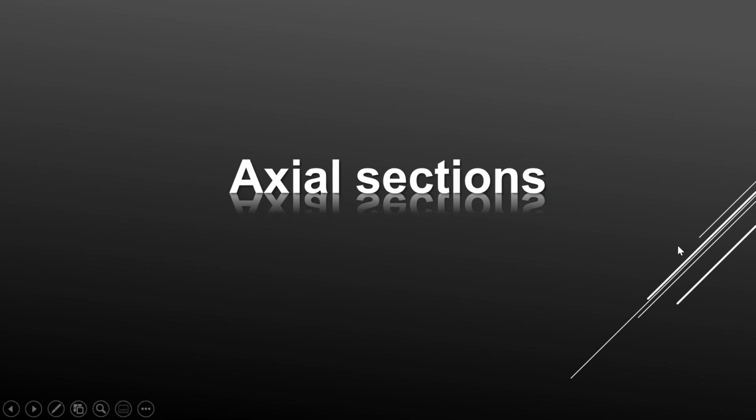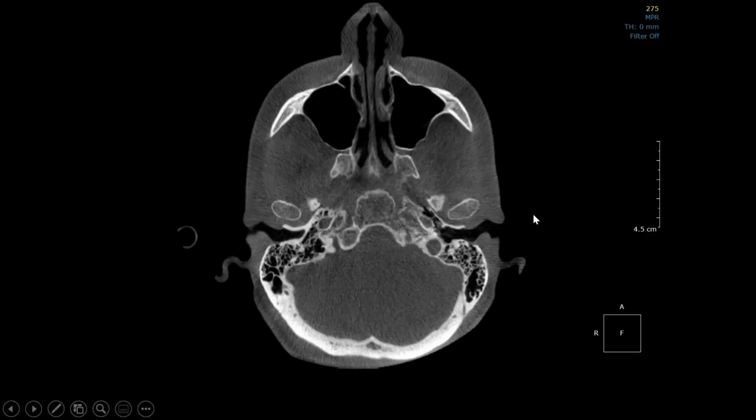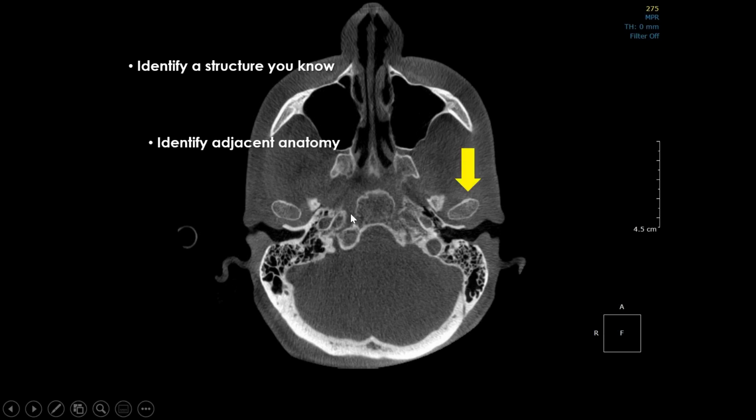So let's go to the, excuse me, the axial sections. This is a section right through the condylar heads, and there's some important structures to identify in here. What I suggest you do when you're first learning this is identify a structure you know, like the condyle, and then move away from that to something adjacent. If you go behind the condyle, you'll see a little opening. Well, this is the external auditory canal, and this will be the internal auditory canal. And sometimes you'll see the little ossicles within here. So the EAM will show, as you move to another region behind the external auditory canal or meatus, you can see the mastoid air cells. So those structures should be very familiar to you.